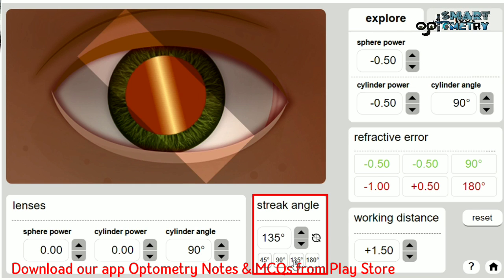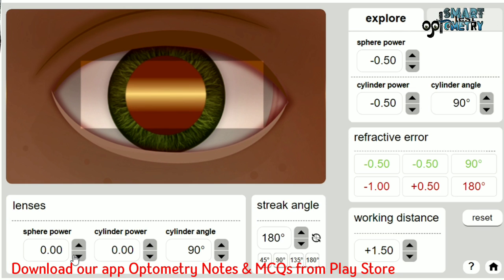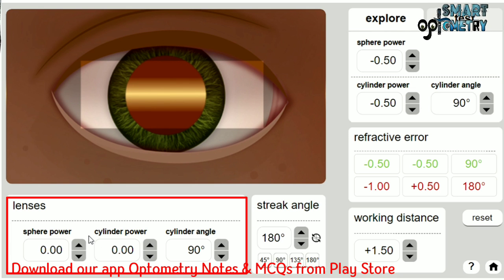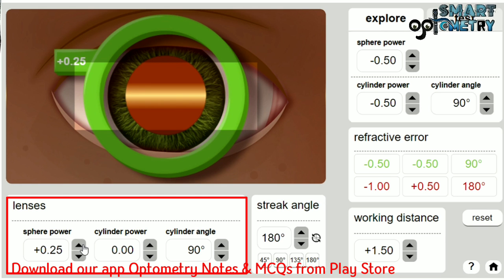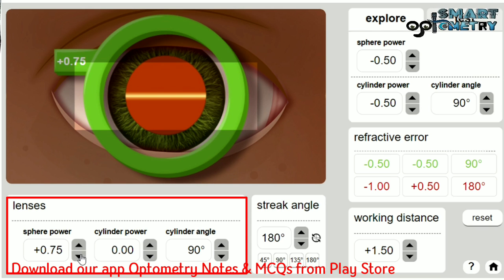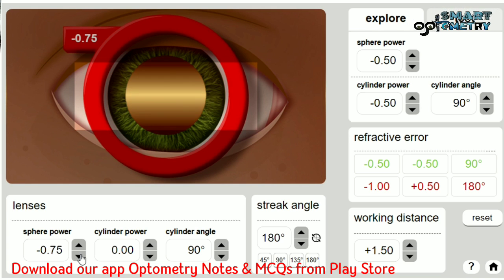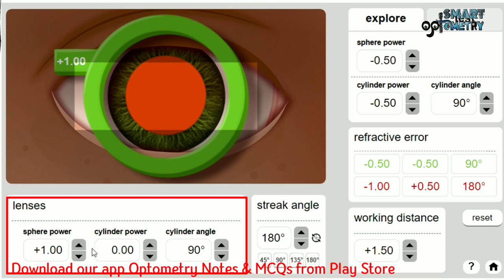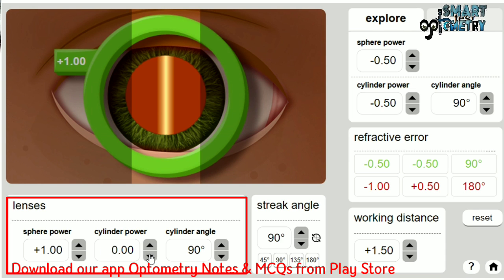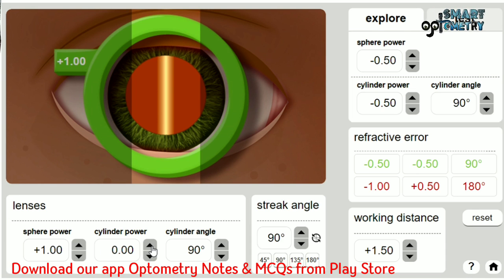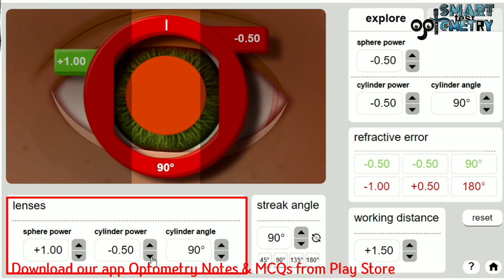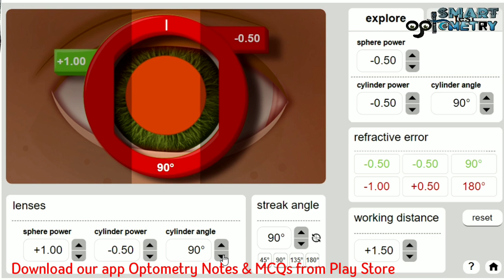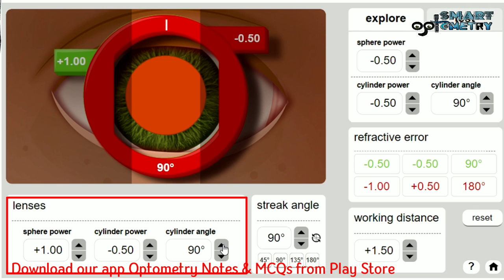Here you can choose the orientation of the axis and select your working distance power. Here you can choose the angle of the streak to find the principal meridian. You will use trial lenses to neutralize the patient's refractive error. Spherical trial lenses are available to neutralize one meridian — top button gives plus spherical, bottom gives minus. Cylinder trial lenses are also available — top button gives plus cylinder, bottom gives minus cylinder trial lenses.